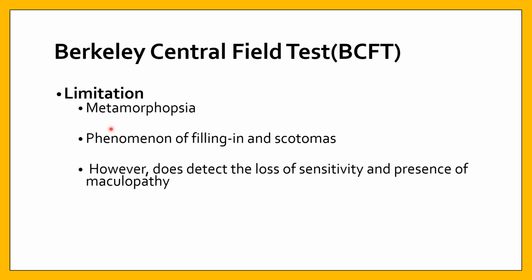Through the Berkeley central field test, metamorphopsia and the phenomenon of filling in of scotoma cannot be detected. The phenomenon of filling in means an empty region of visual space appears to be filled with the colors, brightness, or texture of the surroundings. However, it detects the loss of sensitivity and the presence of maculopathy.